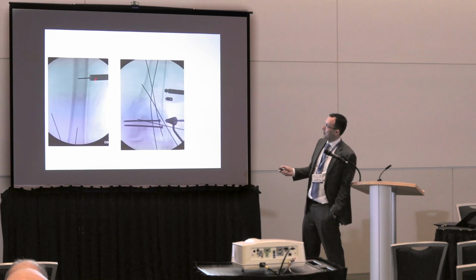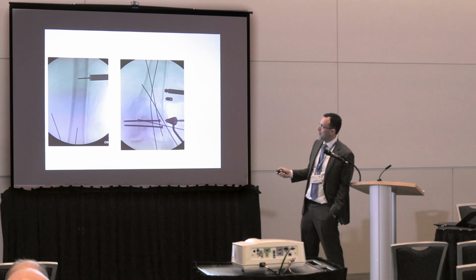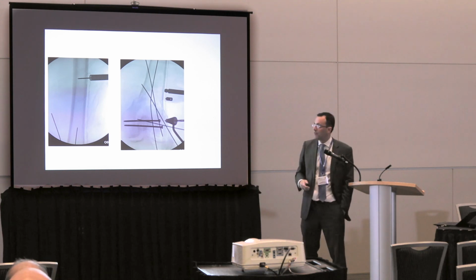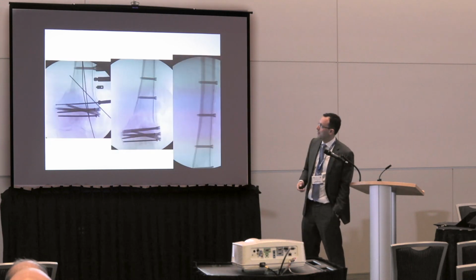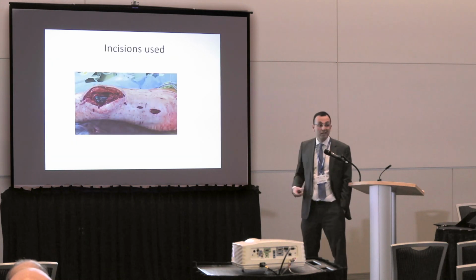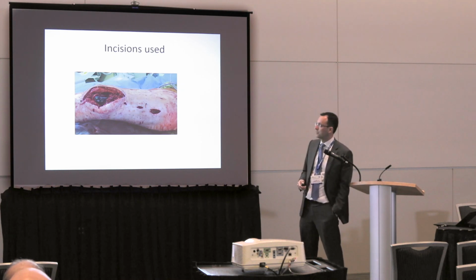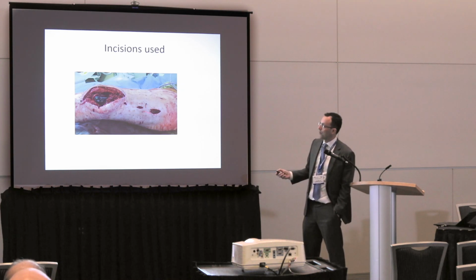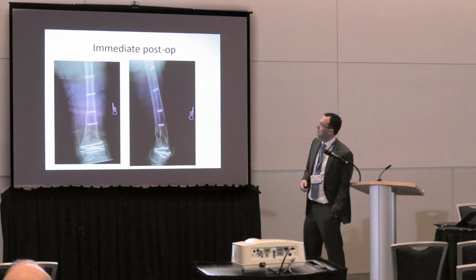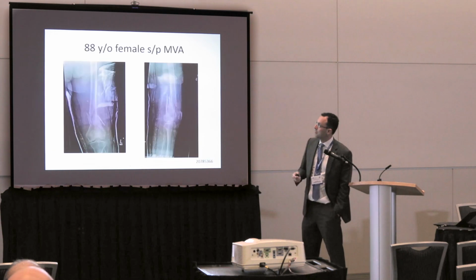And so there you go. This is actually one of my first cases. So I've made the box. Then this has a little cone shape, so you can selectively choose your angle within a certain degree of certainty. And there you go. There's the implant, and that's what it looks like post-op, right? Pretty straightforward and very, very similar to what you're used to with the current technology. And this probably was more liberal than I would make now, but again, it was one of my first cases. And this is the immediate post-op on that patient.